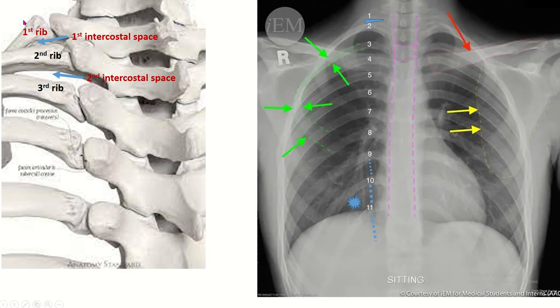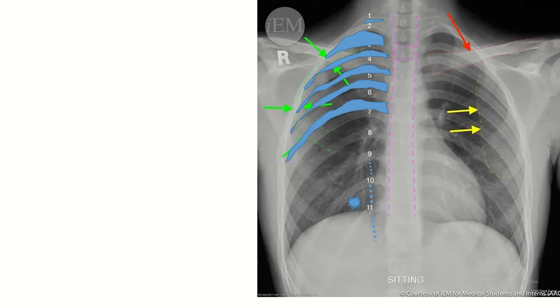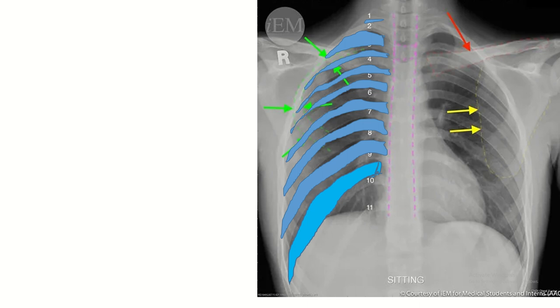Continuing the count: 6th, 7th, 8th, 9th, 10th, 11th. This is the first rib with the costo-transverse joint visible; the costo-vertebral joint is not seen in this picture. This is the narrowest first intercostal space, then the second, third, fourth, fifth, sixth, seventh, eighth, ninth, tenth, and eleventh intercostal spaces on this posterior-anterior chest X-ray.